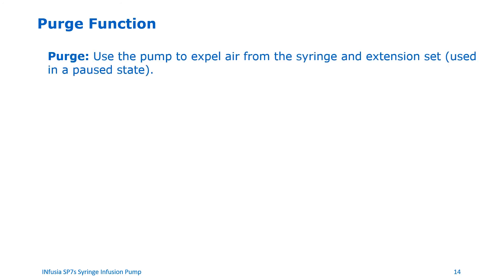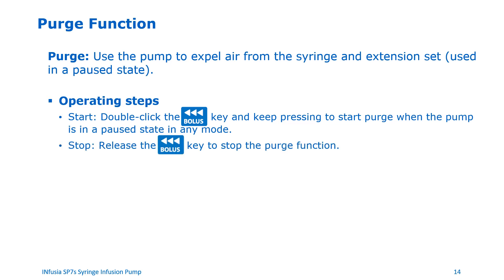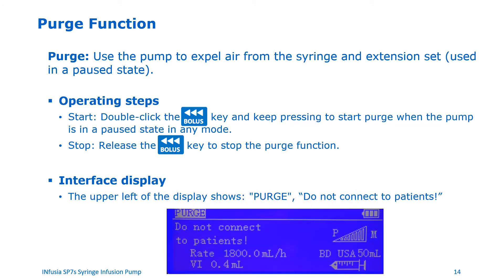Purge function. Please make sure that the set is not connected to a patient while using the purge function. The purge function is used to expel air from the syringe and extension set, and can be used only when the pump is in a paused state. To start the purge function, double click the bolus key and keep the bolus key pressed when the pump is in a paused state in any mode. To stop the purge function, simply release the bolus key. When the pump is in the purge function, the upper left of the display shows "Purge, do not connect to patient."